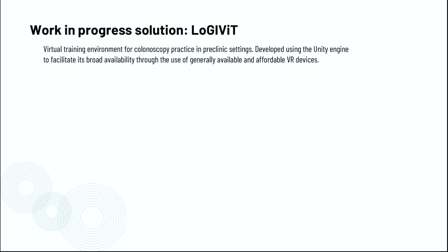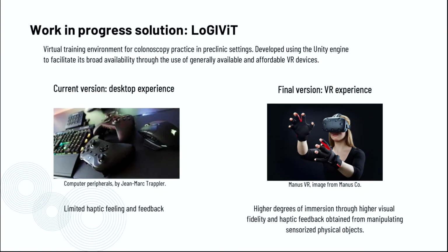This work in progress presents a virtual training environment, LOGIVIT, or Lower Gastrointestinal Virtual Trainer, as a solution for colonoscopy training. The current prototype is a desktop experience with gamepad or mouse and keyboard control. The final version will be a full VR experience to provide the visual fidelity and haptic feedback required to reach higher degrees of user immersion.